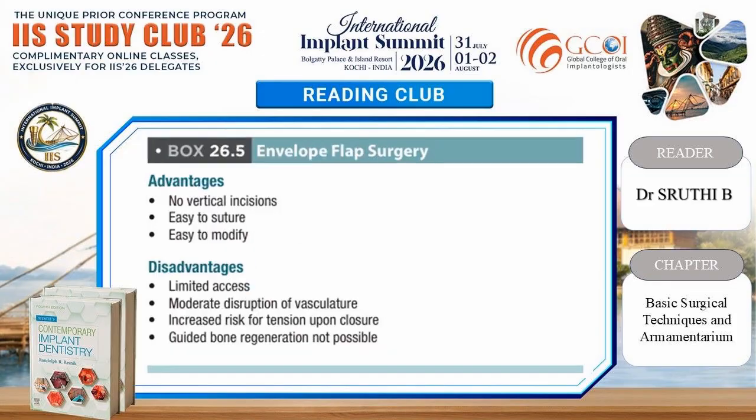Envelope flap surgery. Advantages: no vertical incisions, easy to suture, easy to modify.